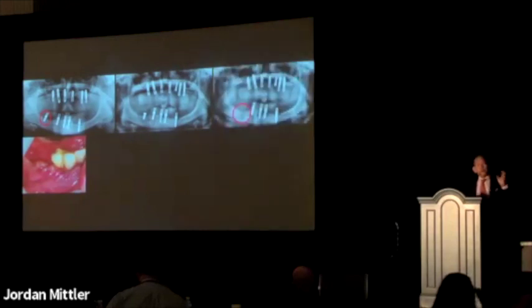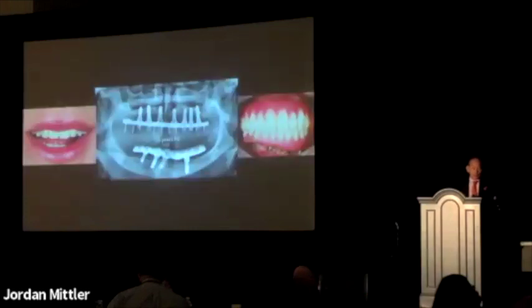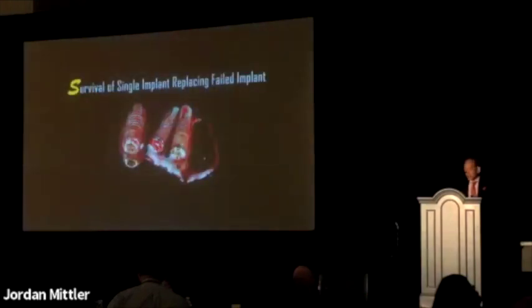But this time, because we have drilled so many holes, there's so much Swiss cheese in the jaw, and the bone that regenerated is essentially poor quality bone, the patient developed osteomyelitis. You can see from the CT scan there that the bone had completely rotted from the top all the way to the bottom. And now the patient was developing a fistula through the neck there. So imagine telling a patient that we're going to resect her jaw for an implant. So sometimes, these are site issues. We were able to treat her with long-term IV antibiotics and debridement without resecting her jaw.